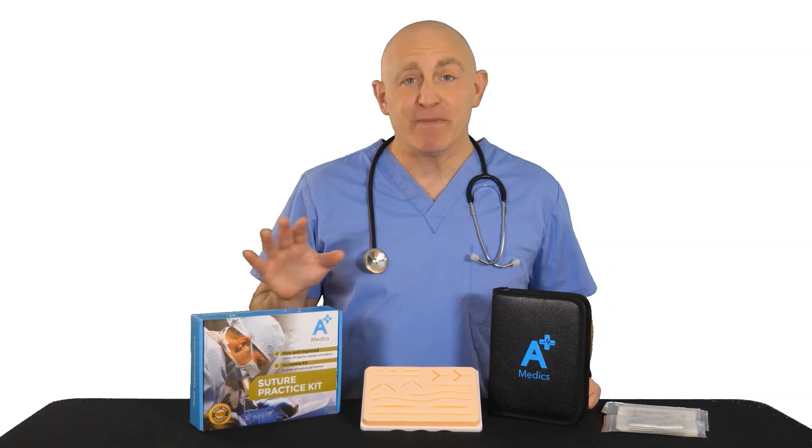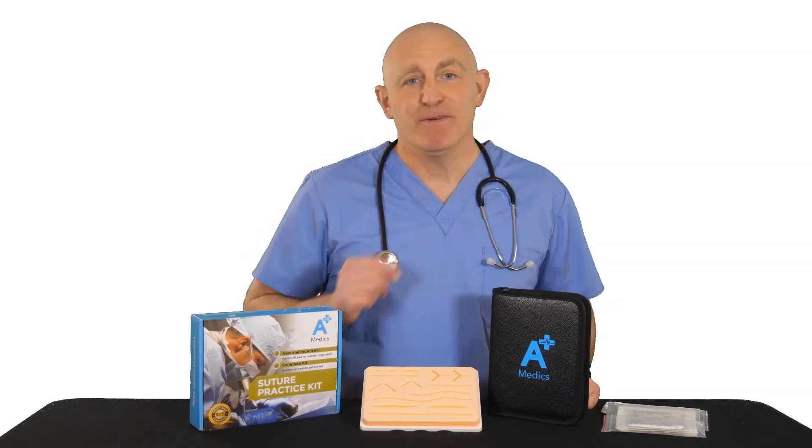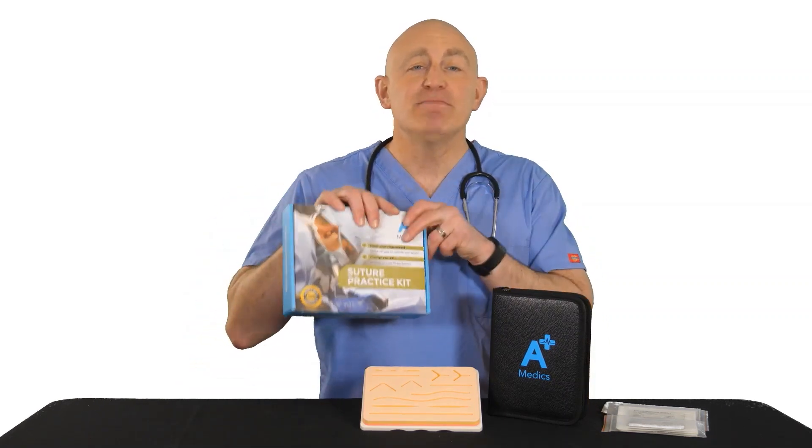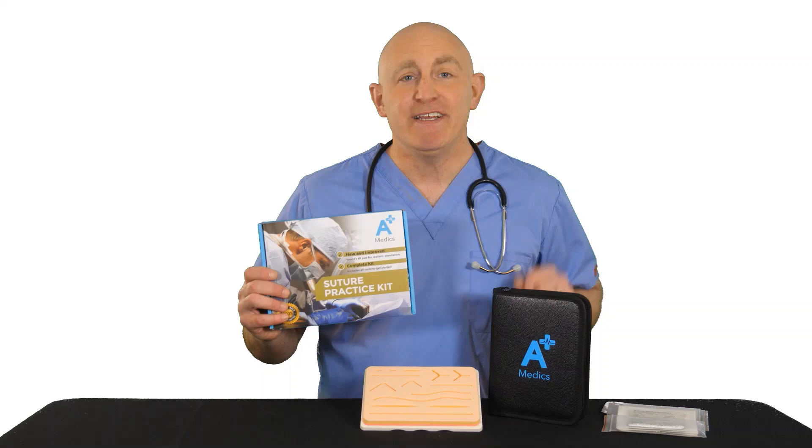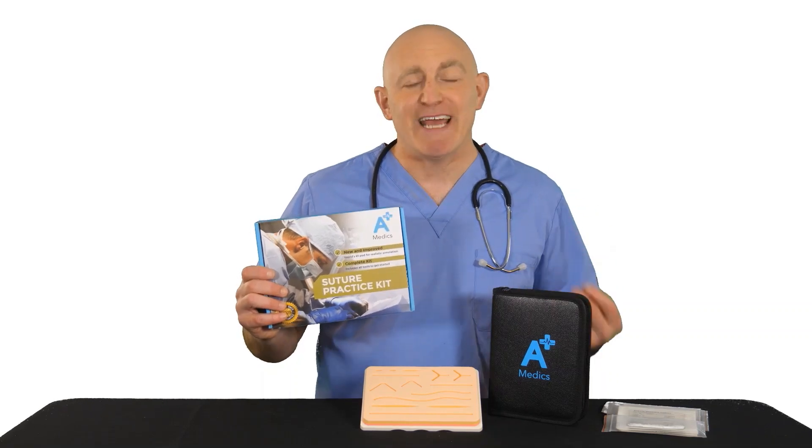Are you a medical, nursing, or physician assistant student, or just looking to learn how to suture? Look no further because we have the solution for you. Our complete A-Plus Medics kit contains everything you need to get started on your journey to become a suturing expert.